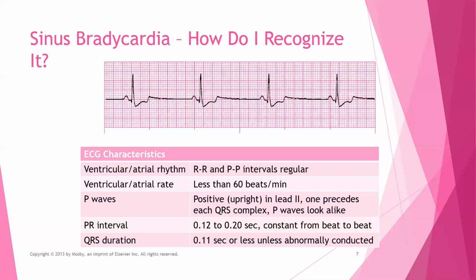So 300, 150, 100, 75, 60, 50, 42. And then I've got a couple of little boxes. And I'm so sorry, that's my dog in the background who thinks she's ferocious. So ultimately, my rate is about 40. But otherwise, my QRS is within normal limits.